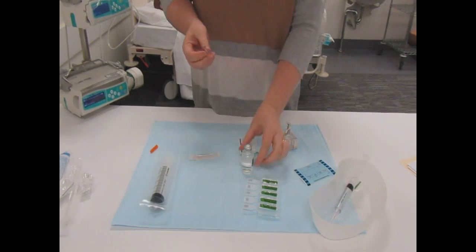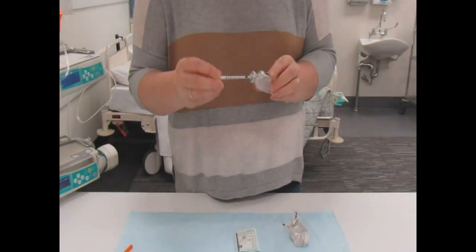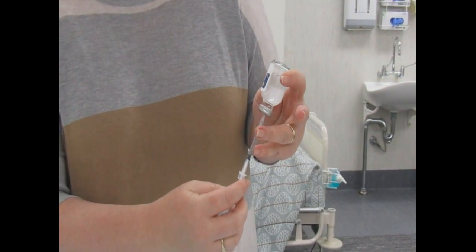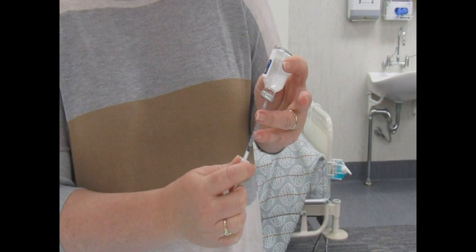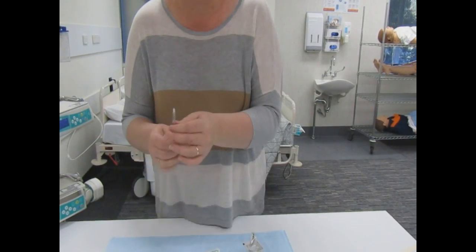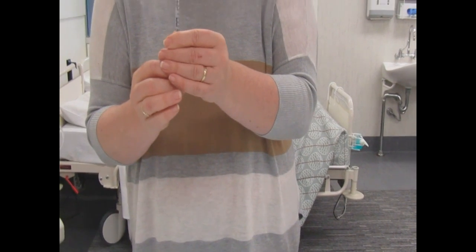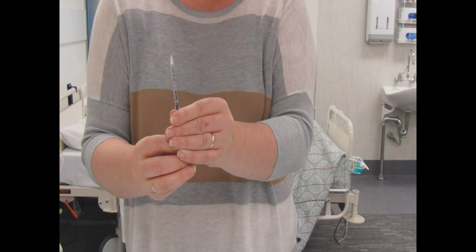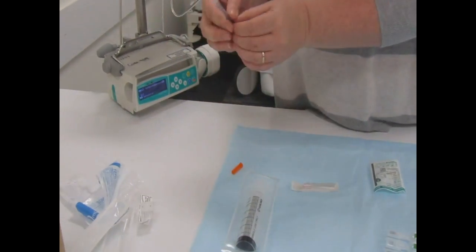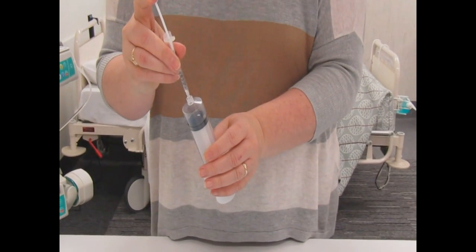Opening my insulin syringe — we need 50 units, which is right to the base here. I'm going to put that centered and draw back. If you've got some little air bubbles, as I do, I'm just going to draw back a tiny bit more to get rid of those, and make sure you hold on to the ActRapid until everything's been finished. Then I'll grab my 50ml syringe, pull the plunger back, and put the insulin syringe straight in, injecting the insulin.